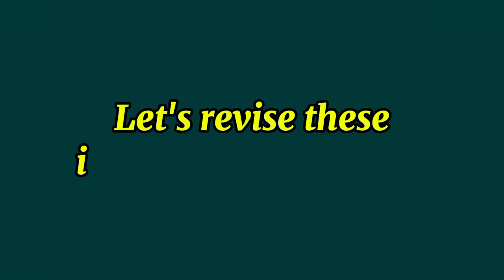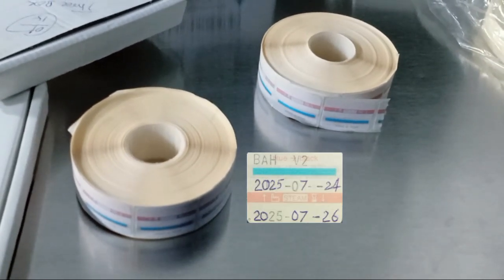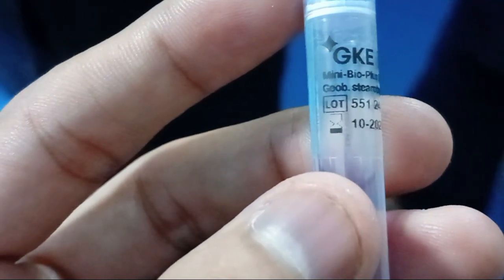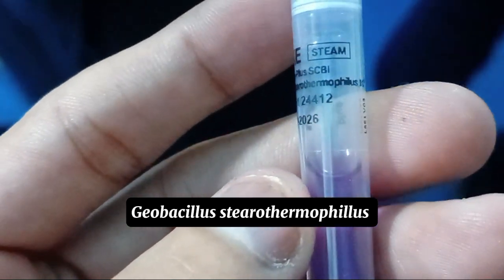Let's revise these indicators one by one. Steri-Gage tape that turns its blue color into black after sterilization. This is a biological indicator, Geobacillus stearothermophilus, added in PCD to ensure sterility.